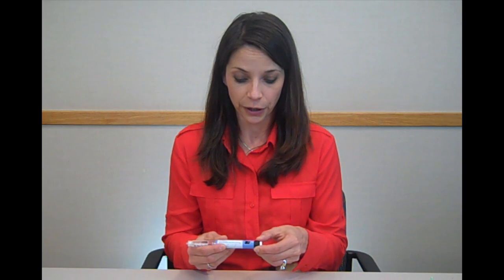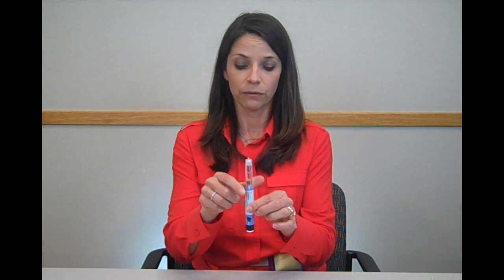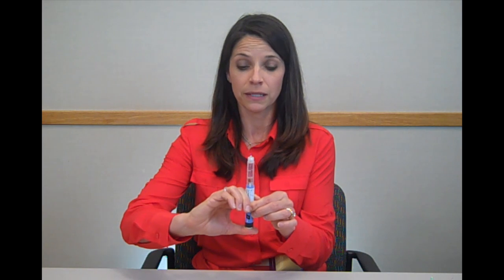Remove the outer cover and set aside. In order to prime your pen, you're going to turn it to the flow marker so the two lines match up. Hold your pen straight in the air and push in the dose knob until it gets to zero. You want to see liquid come out of your pen needle. If you do not see it, you may repeat these steps up to six times. Once you see liquid come out of the pen needle, you know that your pen is ready to be used.